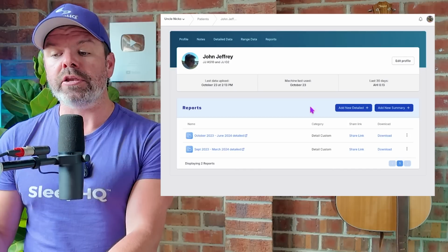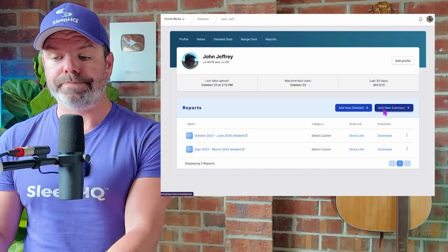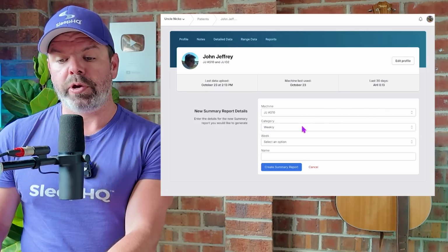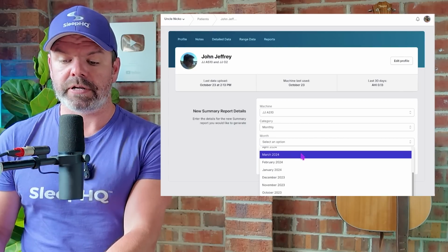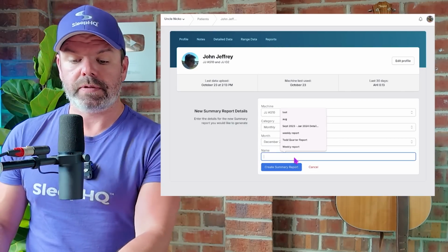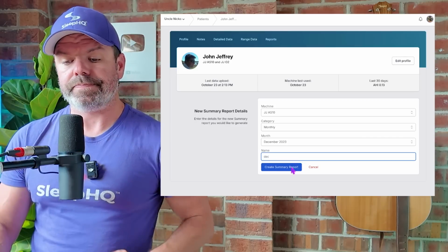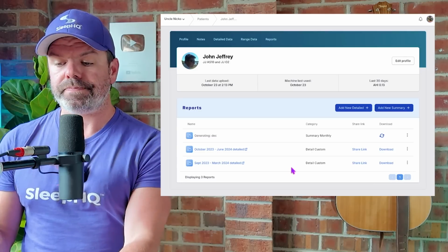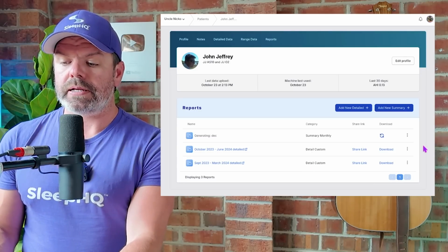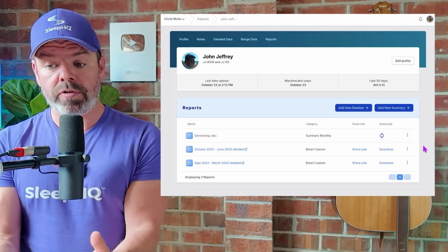And then we're going to add a new summary report. We're going to choose monthly, and I'll just choose, I don't know, let's go December. Give it a name. Create summary report. And just give it a moment for it to generate the report.